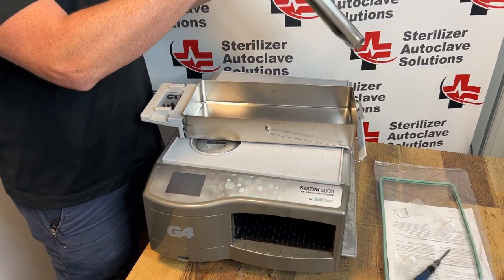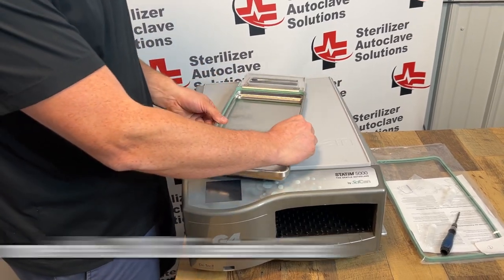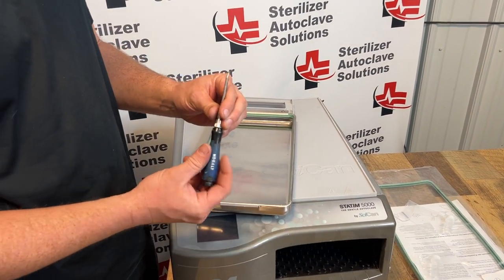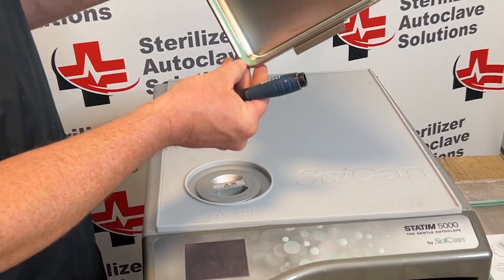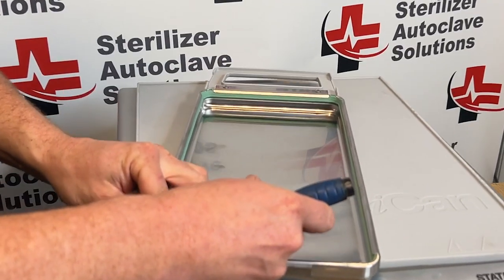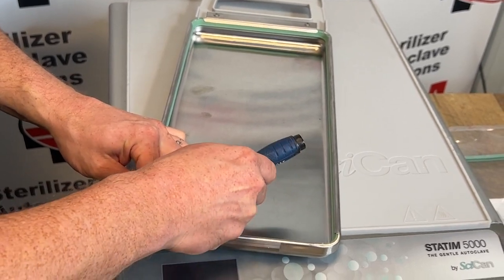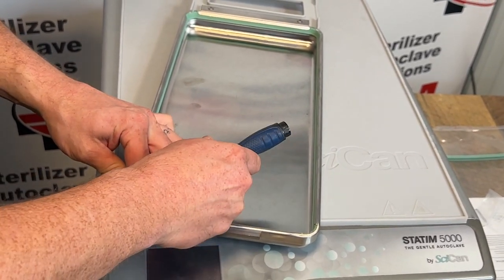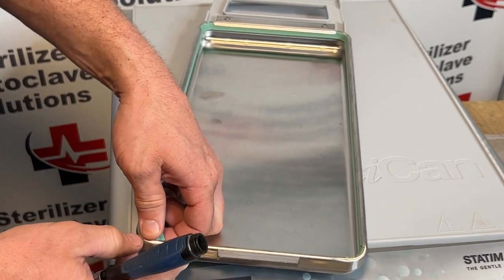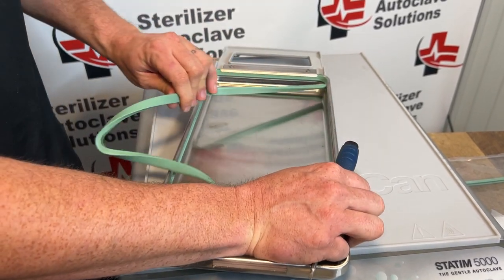I'm going to separate the top from the bottom. Next I'm going to take a small flathead screwdriver and get behind the seal in one of the corners. I'm going to gently — without stabbing the seal — get on the back side, and once you get a corner kind of popped out, the rest of the seal should roll all the way out.